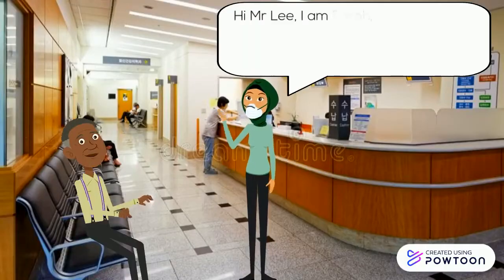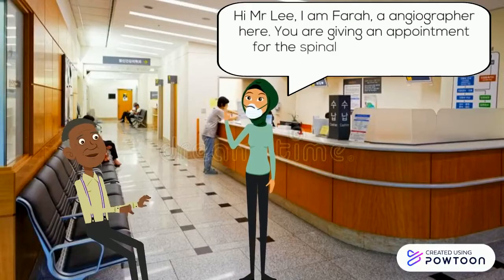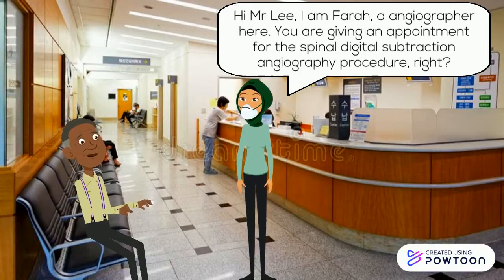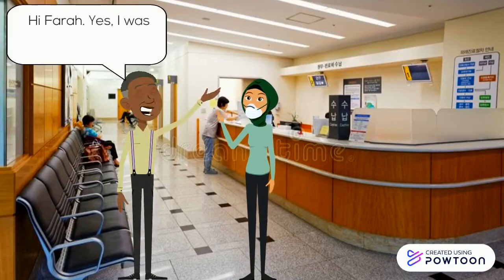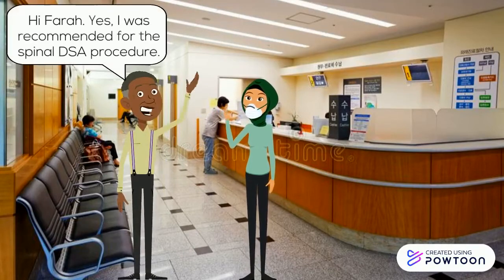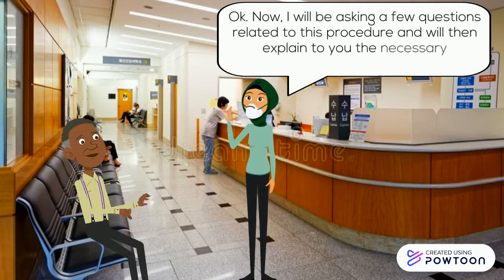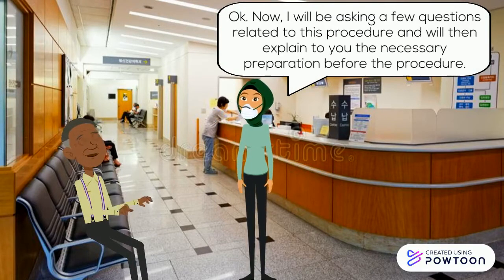Hi Mr. Lee, I am Farah, an angiographer here. You are given an appointment for the spinal digital subtraction angiography procedure, right? Hi Farah. Yes. I was recommended for the spinal DSA procedure. Okay. Now, I will be asking a few questions related to this procedure and will then explain to you the necessary preparation before the procedure.